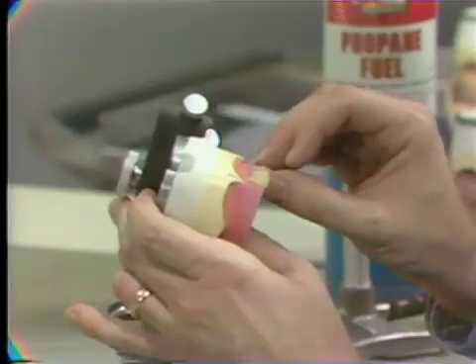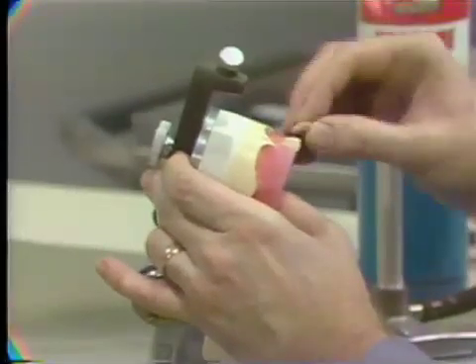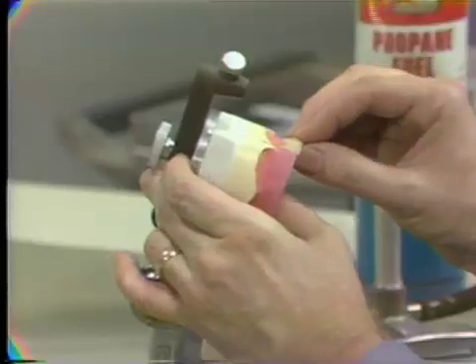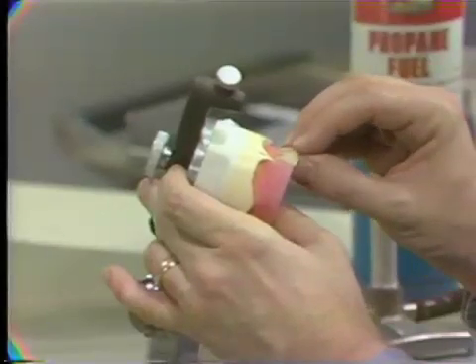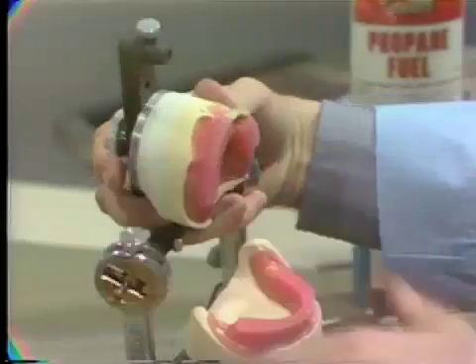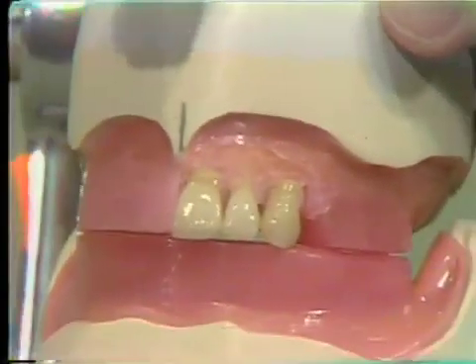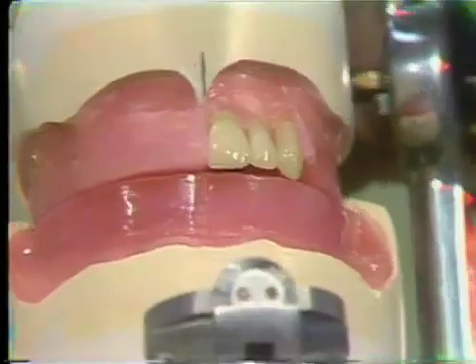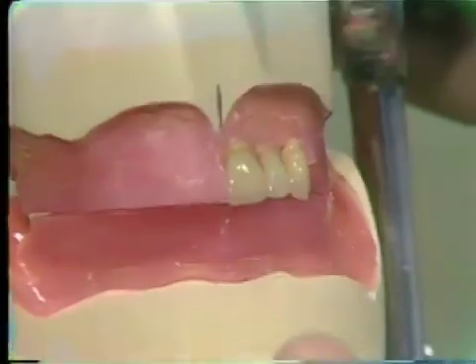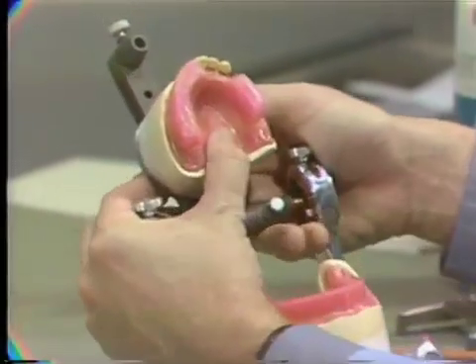This tooth also, if you pay attention when you look at your own teeth in a few moments in the laboratory, you'll notice that there is some incisal wear placed on the tooth. It looks very natural for certain types of people to whom it would be selected for in the actual case, and it already has the incisal wear. At this point, this is just an initial setting, and I'm sure I'm going to have to make some minor adjustments in a moment. But at this time, the incisal edge is, again, about a millimeter below the occlusal plane, and it is also in alignment with the other two teeth. Now I'll open the articulator and we'll look directly in at the upper arch.